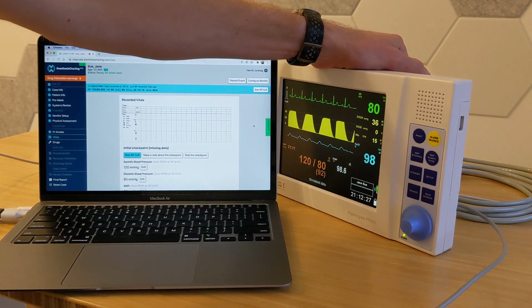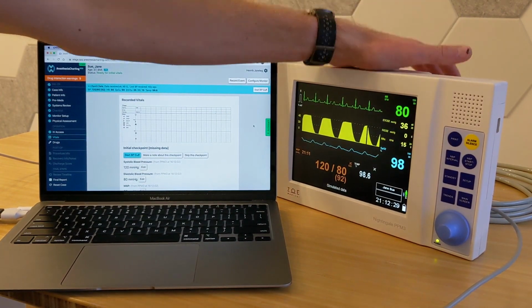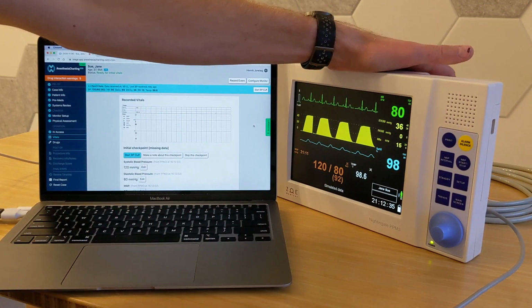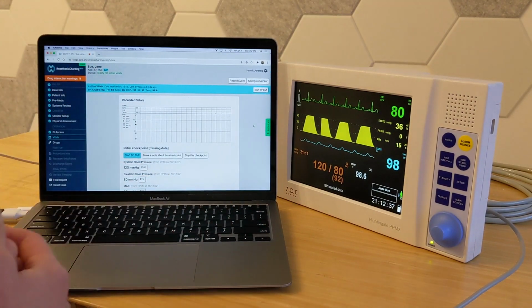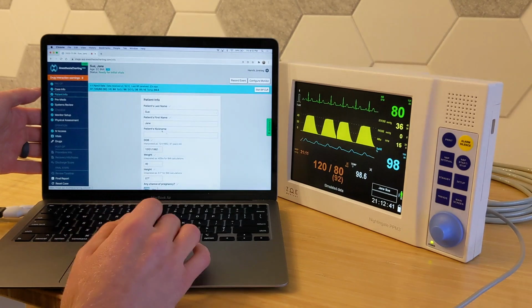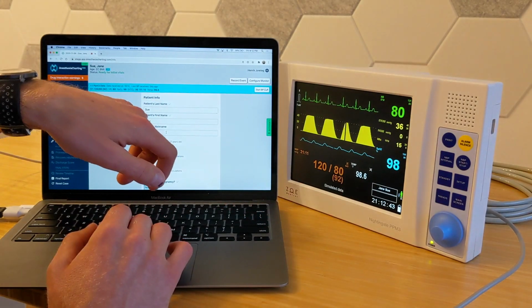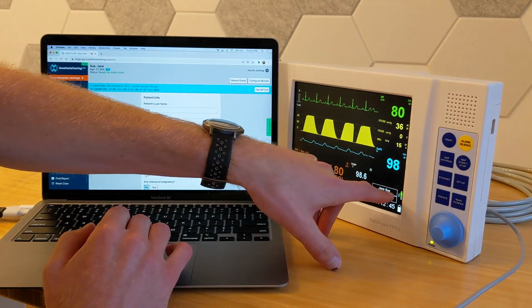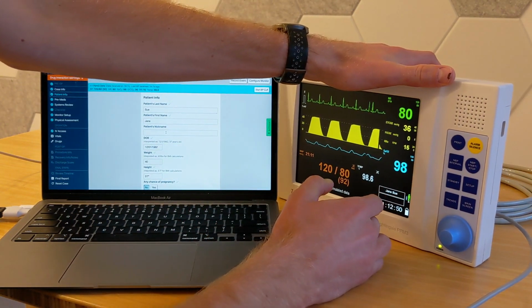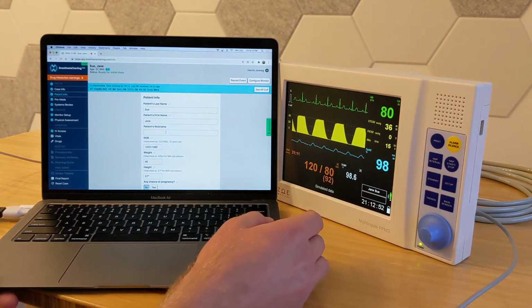So that's one of the really cool things about the PPM3 monitor, is that we have what we call the VitalSync feature, which means that we can actually send it commands. So not only can we start the blood pressure cuff, you can also do a few other cool things. So if I go to patient info, you'll notice here that the patient name that I put in here is actually what shows up here. And in addition, you'll see this big person and little person icon here, and that's for adult or pediatric settings.